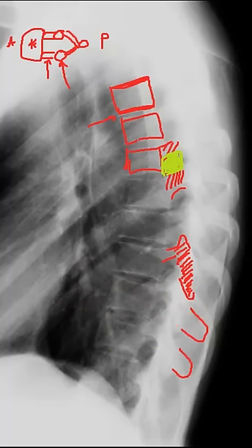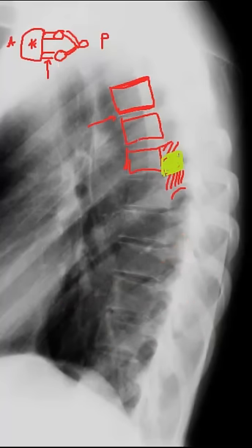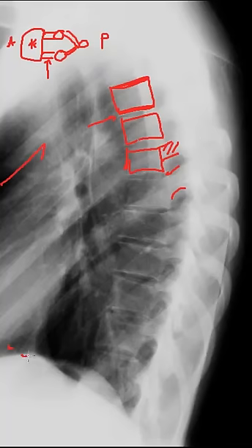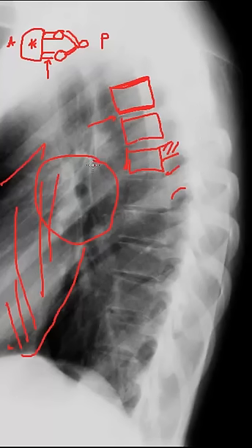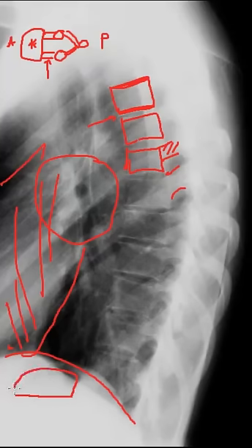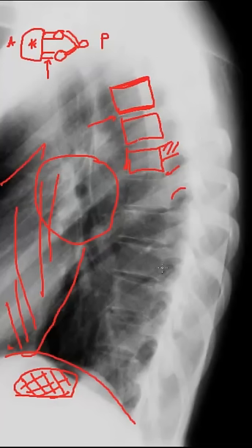Now there are some other soft tissue structures that are very well visualized. Coming back to the mediastinal region — this is the heart. This is the hilar region where our pulmonary arteries, pulmonary veins, and main stem bronchi enter and exit the hilum. Here is the diaphragm. Here's a portion of the gastric air bubble, also known as the Magenblas — this is actually air in the fundus of the stomach. This region will be visualized as an air density just inferior to the diaphragm. And those are the majority of the structures that we can see on lateral thoracic views.